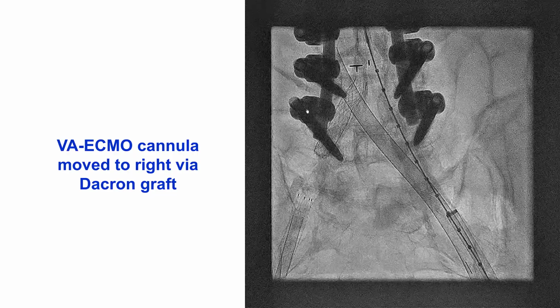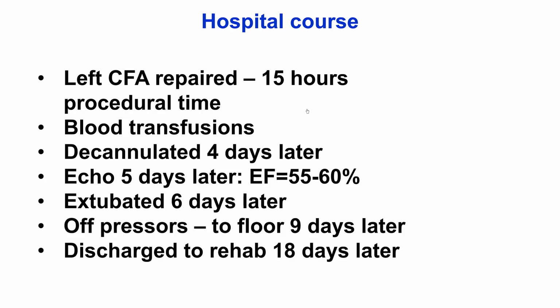So the cannula was moved to the right side, and then the patient eventually went to the unit. It took 15 hours of procedure time from the beginning all the way to the end. The patient did receive blood transfusions, and he did have a long hospital stay. However, he was decannulated 4 days later.